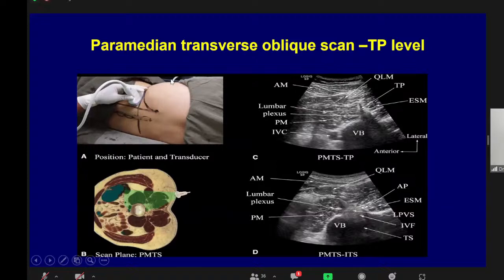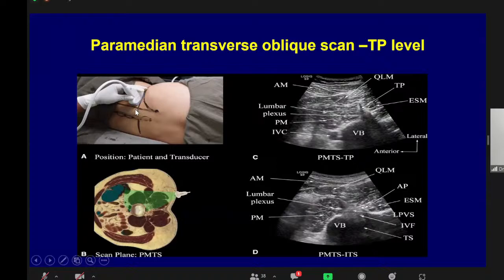Another approach is the paramedian transverse oblique scan at the transverse process level. Instead of placing the low-frequency curvilinear probe just above the iliac crest, we tilt it down to four centimeters from the midline, with the probe's other end over the PSIS/intercristal line intersection point, making it slightly oblique. The advantage is that in-plane needle visualization is easier since the needle is close to the probe. The transverse process, vertebral body, and all muscles can be nicely seen in this technique as well.